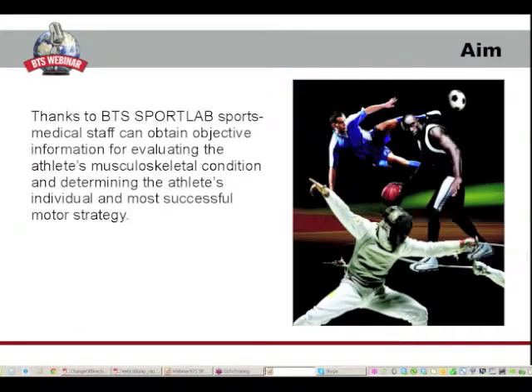With BTS SportLab, sports medicine staff has a scientific support to improve performances, plan individual training programs, identifying correct deficiencies in the athletic preparation and reduce drastically the risk of sports injuries. Objective information can be obtained for evaluating the athlete's musculoskeletal condition and determining the athlete's individual and most successful motor strategy.